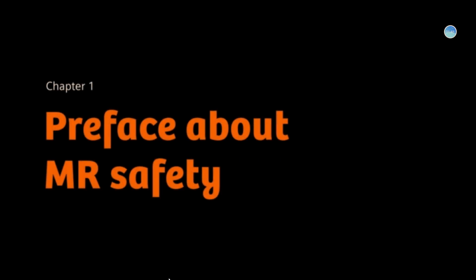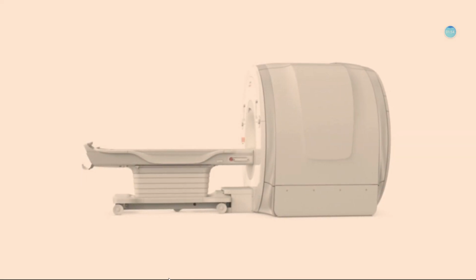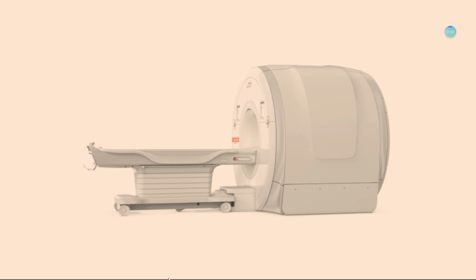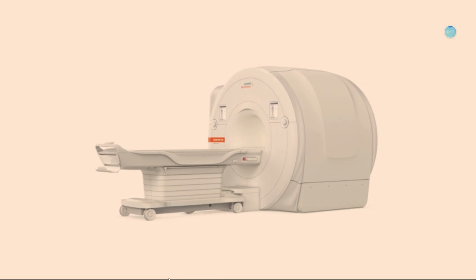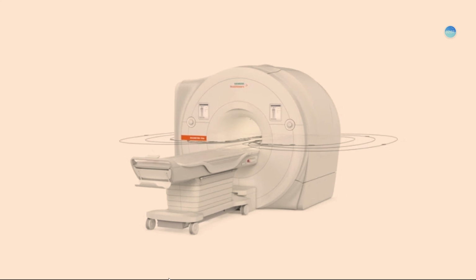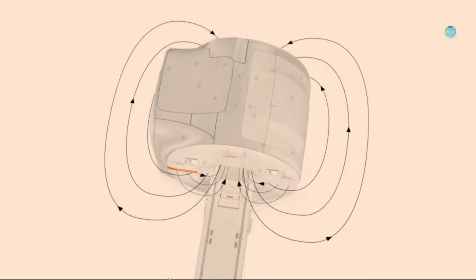Chapter 1, Preface about MR Safety. In this video, you will learn more about the MR systems, the types of magnets, and the magnetic field. In addition, we'll provide an overview of different types of device labels for ferrous objects. Let's have a look at the core of a MR system, the magnet.